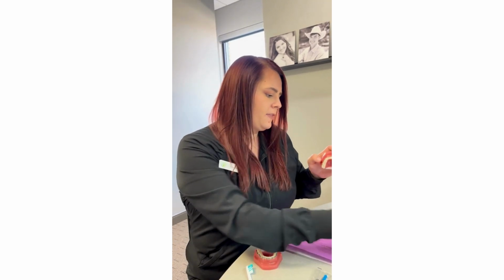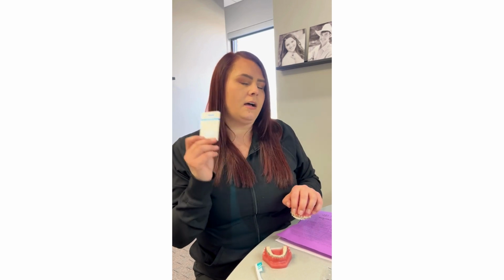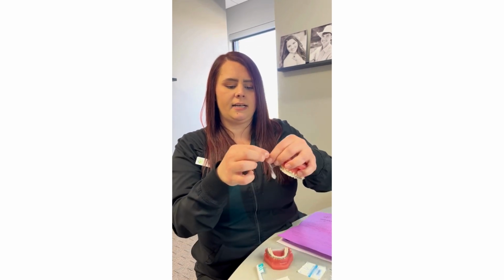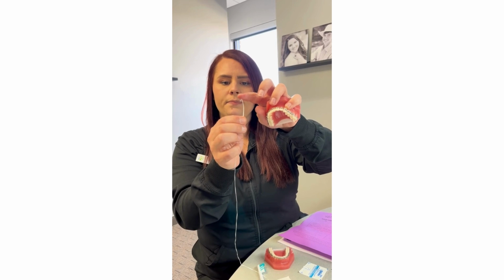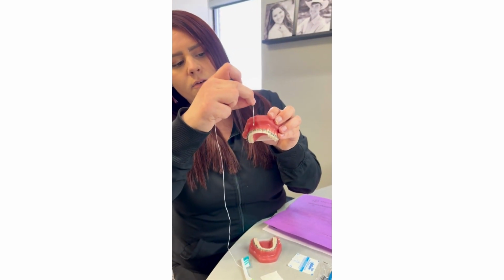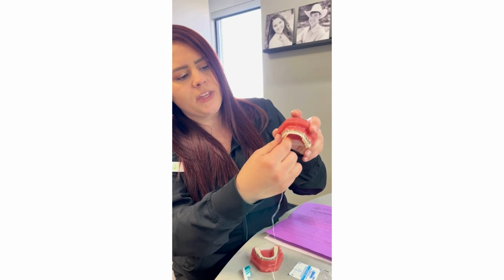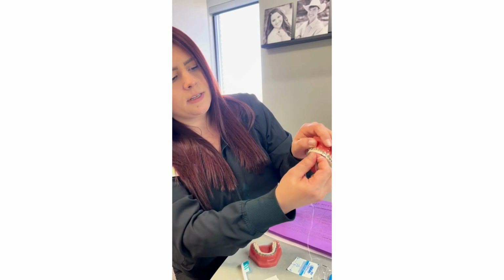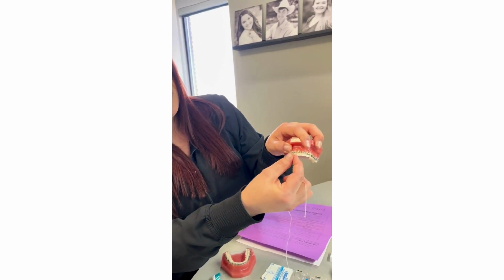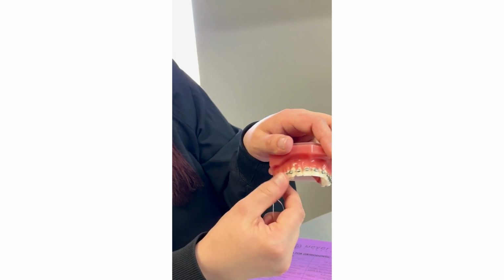Once you have the brushing done, we are going to floss. So you're going to get some flossers here. You can get any of these products at Walmart, Walgreens, Target, anywhere that has a dental aisle. This one is nice because it has a plastic tip, and this tip is going to help you get underneath the wire between the brackets. So from here, you're going to go down towards the brackets with the floss. That will help get underneath. You're going to pull it, and floss the side of the tooth here in a C shape, pull it over and floss the other side of the tooth in a C shape, pop it out, pull it through, and then go to the next one and the next one all the way to the back brackets there.